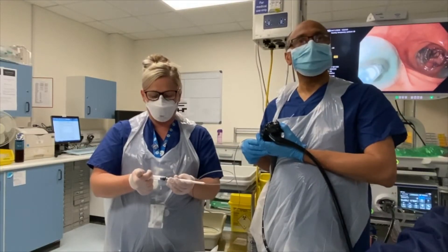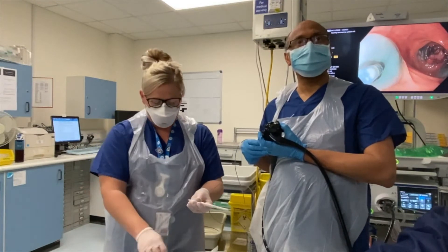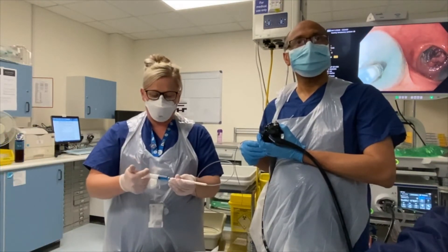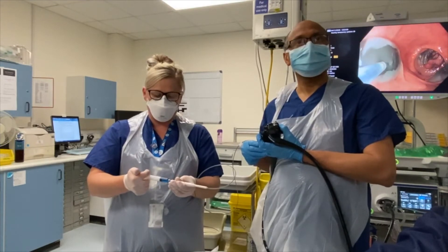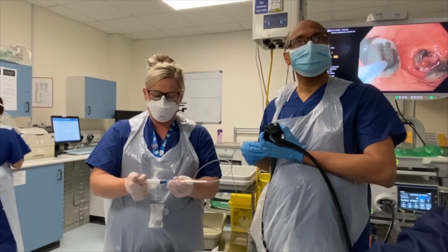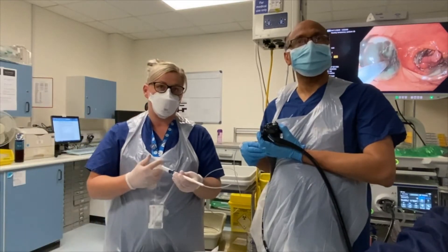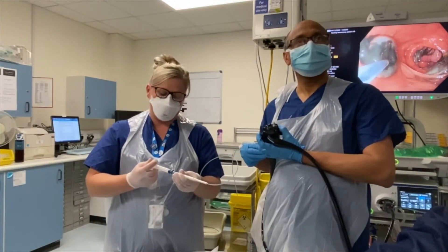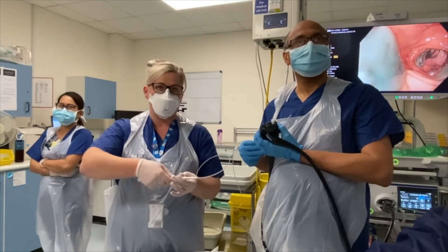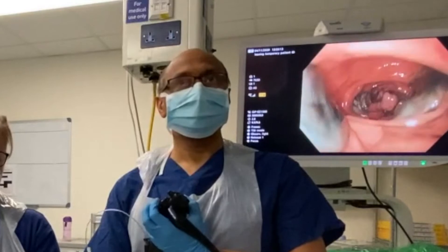Okay, change over and flush another 2ml with our flushing solution. One more ml — one more, one more, one more, one more.